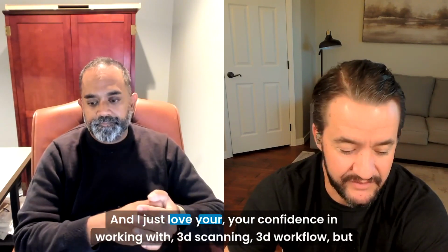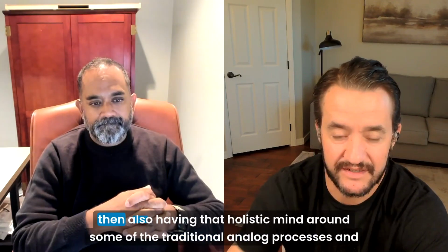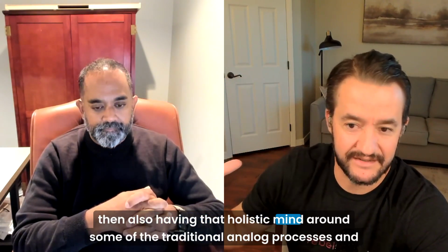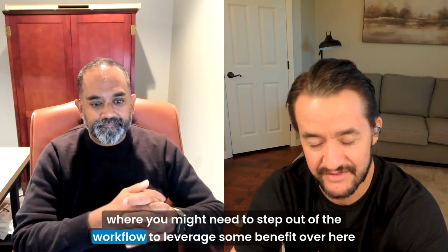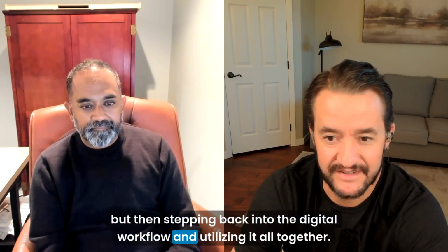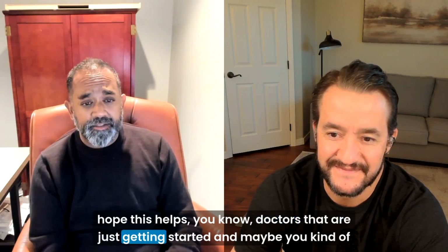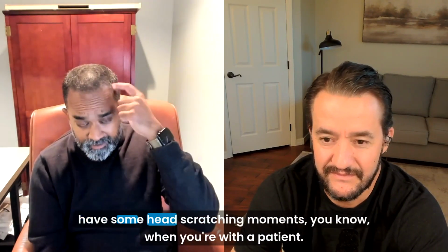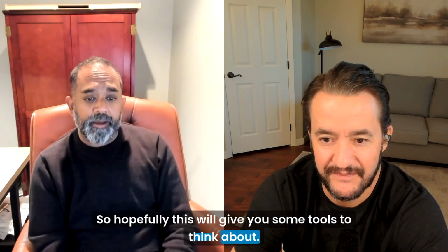Yeah, and I just love your confidence in working with 3D scanning and the 3D workflow, but also having that holistic mind around the traditional analog processes, and where you might need to step out of the workflow to leverage some benefit with an analog impression, but then stepping back into the digital workflow and utilizing it all together. Thank you for that. I hope this helps doctors that are just getting started and maybe have some head-scratching moments when they're with a patient. Hopefully this will give you some tools to think about.